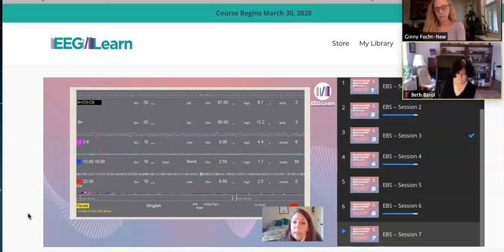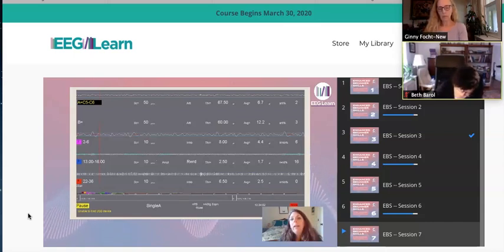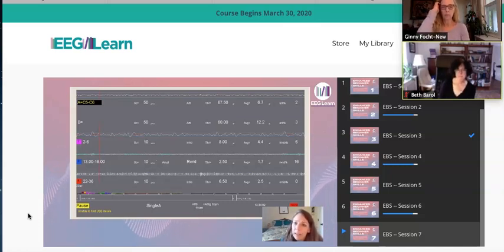Okay, so I'm going to treat both my inhibit thresholds, since those average amplitudes are both lower than they could be, and they have room to come up. It is okay if the inhibit amplitudes start out way lower than they could be. It's okay if they do come up, as long as the activity in your reward band is also coming up.